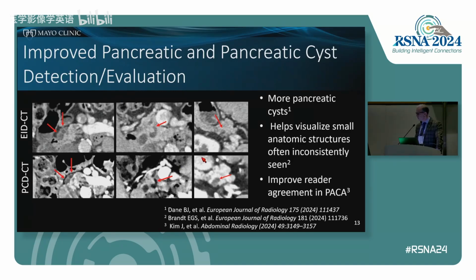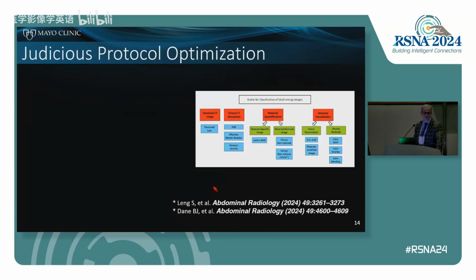So here's an example from our clinical practice, scanned only 7 months apart. You can see there was no mention, you couldn't even see this cyst, which you can make out very well at PCD. And then we can see this side branch duct, which you could follow all the way down to these cystic lesions. The interpretation here was there may be some small cystic foci in the pancreatic head. Down here, 7 months later, it's multifocal side branch IPMN without worrisome features, with a 19 and an 11 millimeter cyst. So a lot more specificity.